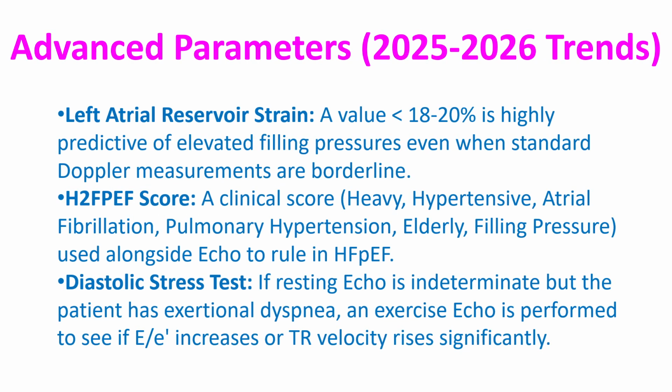While the 2016 criteria are specific, they can be insensitive. Contemporary practice now often includes left atrial reservoir strain. A value less than 18 to 20% is highly predictive of elevated filling pressures even when standard Doppler measurements are borderline.